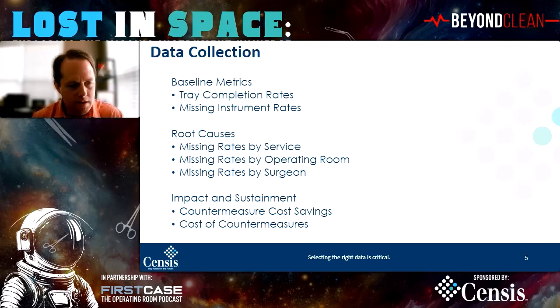It makes it a lot easier to process those trays and reassemble them in sterile processing. But that doesn't always happen. Sometimes they'll mix some of the instrumentation up. And when that happens, a technician in sterile processing assembling the tray finds extra stuff that doesn't belong in that tray. And sometimes that stuff ends up in a drawer.